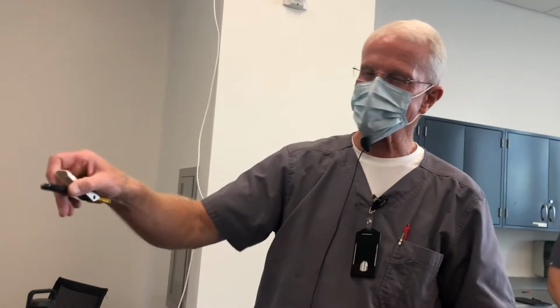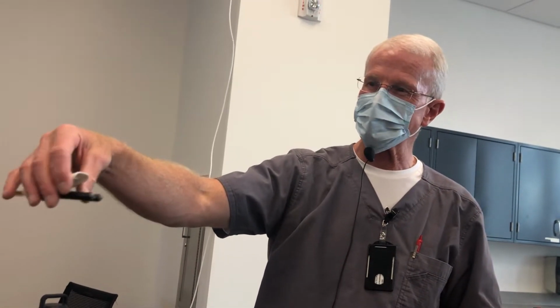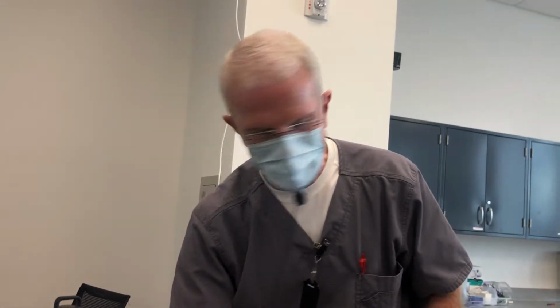Exactly. Sitting there on the bracket table like that, the one side of light cure. Thank you. That did take a while. We got it on there. Thank you. Good job. Don't ever use anything sharper than your fingernail to clean these off with. Metal objects will actually scratch the surface of these. He was using his pocket knife.